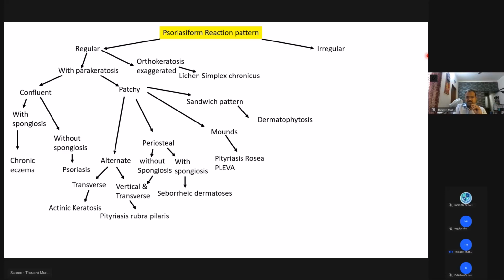These fungi, the spaghetti and meatballs, are entrapped between the corneal layers, which is why it is called a sandwich pattern. You can see round or hyphal structures which are PAS positive. Then you confirm with PAS and get positive for fungal elements.